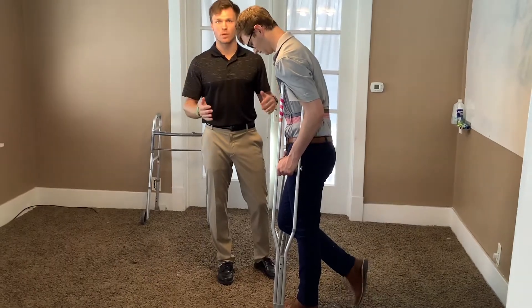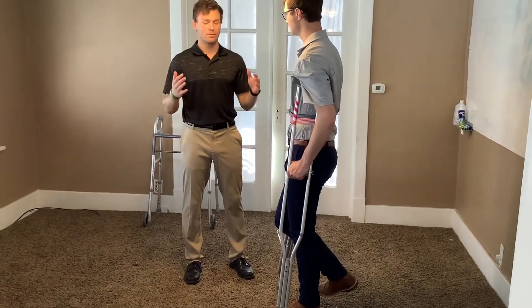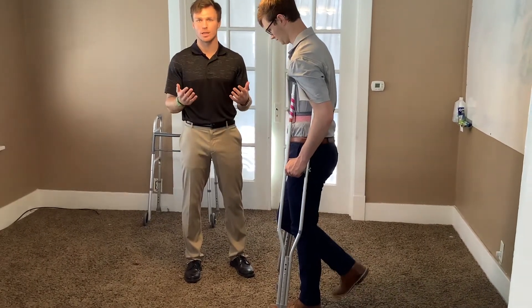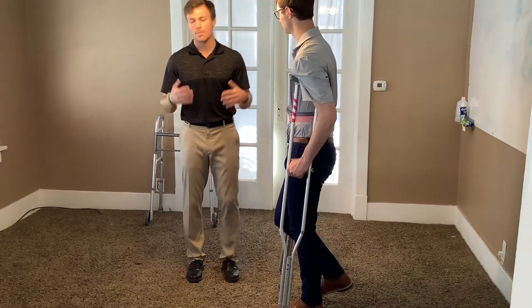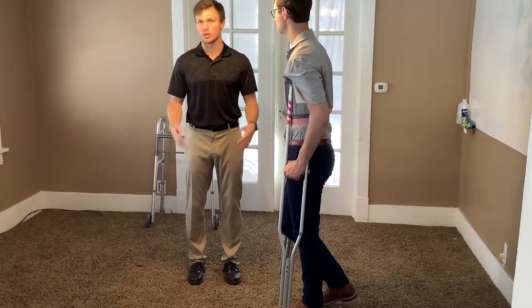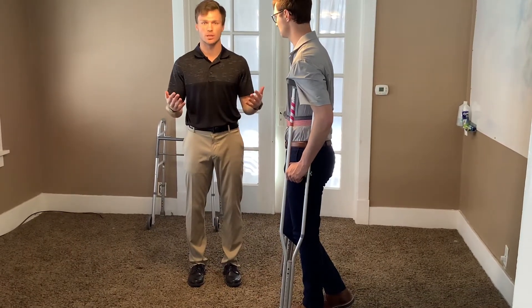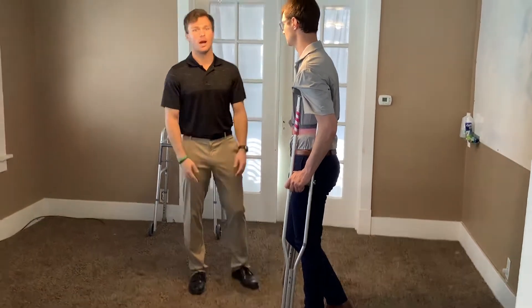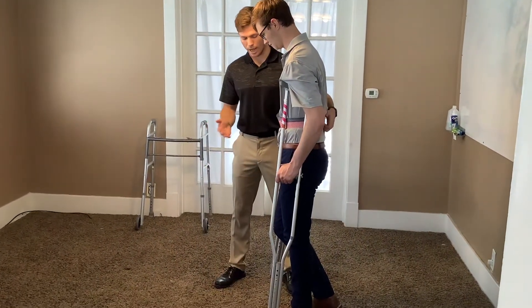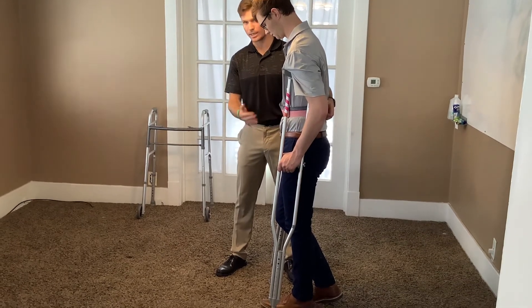We're going to say he's 50% partial weight-bearing. We'll use the same cueing but instruct him to put 50% of his body weight through his affected limb. A good way to educate your patient: imagine standing with both legs on the ground — you're automatically putting 50% through each leg, and that's a good representation of what 50% weight-bearing feels like.